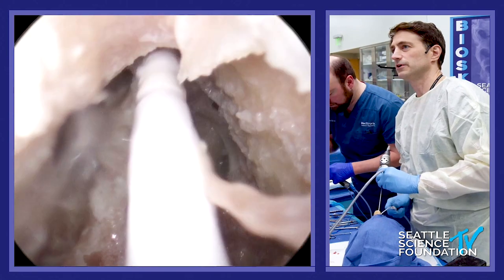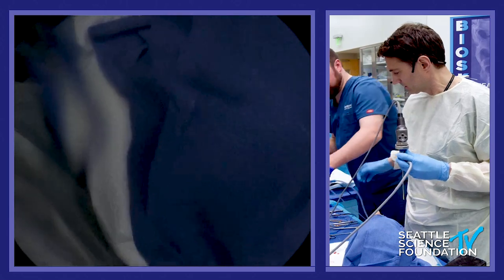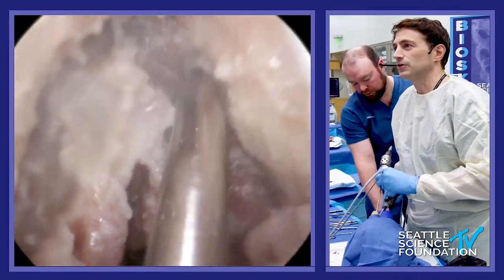That's just mucosa here, so we're doing well. Sometimes it's good to stop and debride the little bits of mucosa.